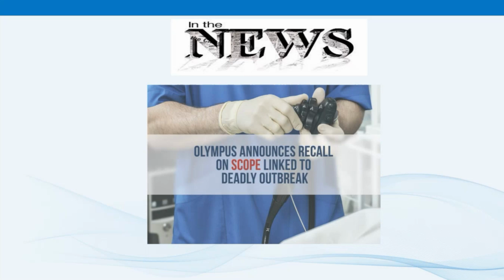In total, at least 35 people at U.S. hospitals died since 2013 after acquiring infections from that contaminated Olympus scope. Cleaning is the most important step in reprocessing because what isn't cleaned can't be disinfected or sterilized.